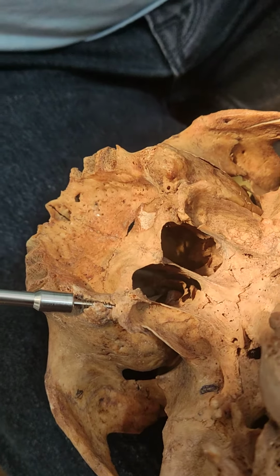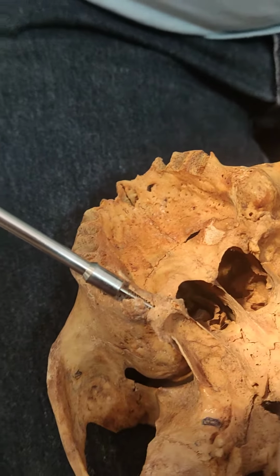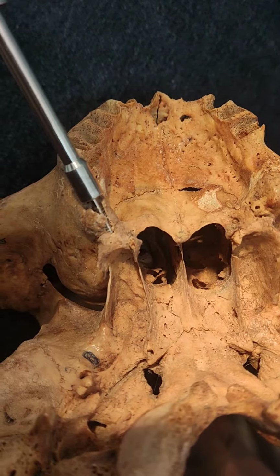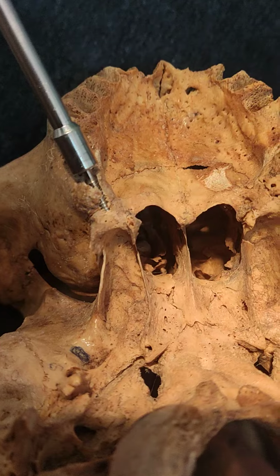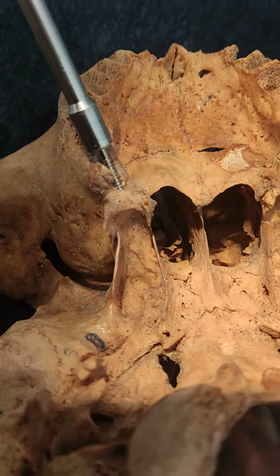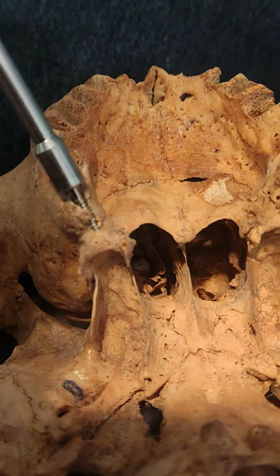Okay, like this. You start engaging, start engaging. It will go engaging. So I'm just engaging the implant. Usually in the pterygoid region, that's between the medial and the lateral pterygoid, you get a good cortical bone. So usually you will get good stability.